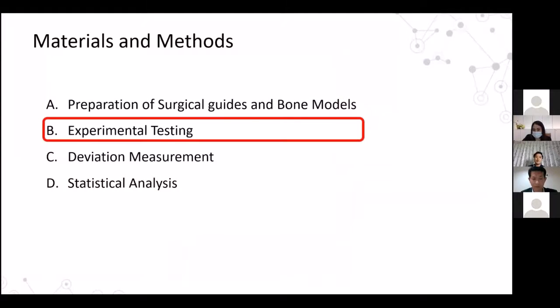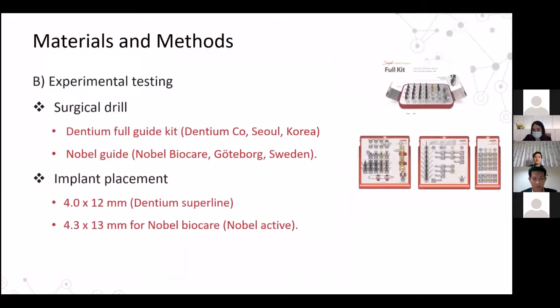Next, experimental testing. We use the surgical guide kit from Dentium and Nobel Biocare.